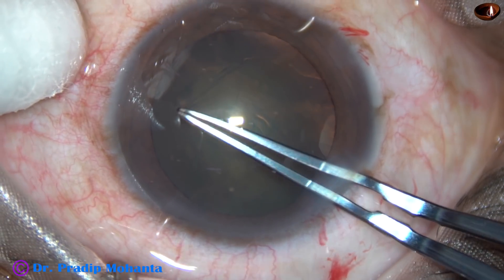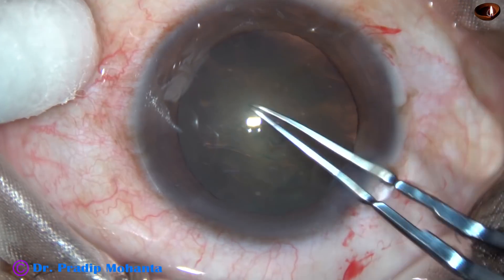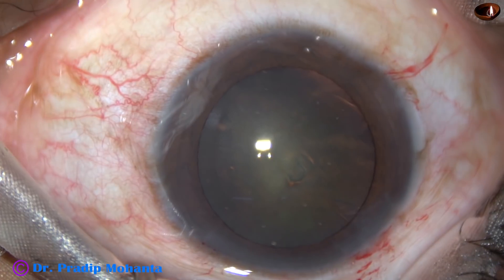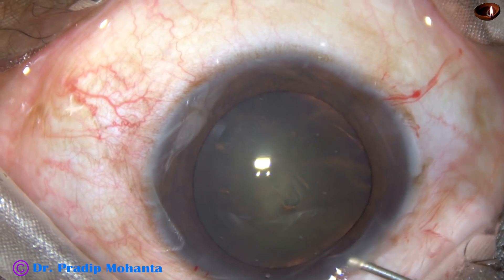It is a new technique to divide nuclei of soft cataracts with the help of a chopper and 27G hydro cannula. I am going to narrate two cases in this video.